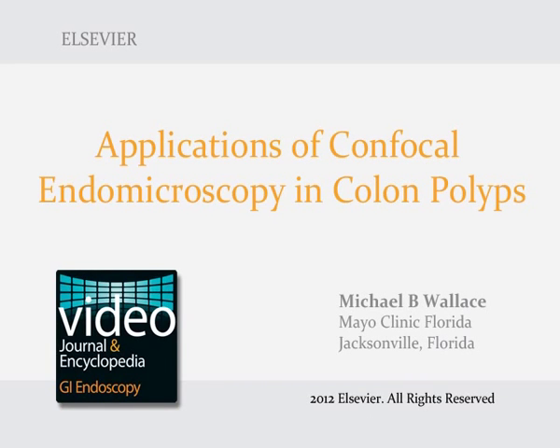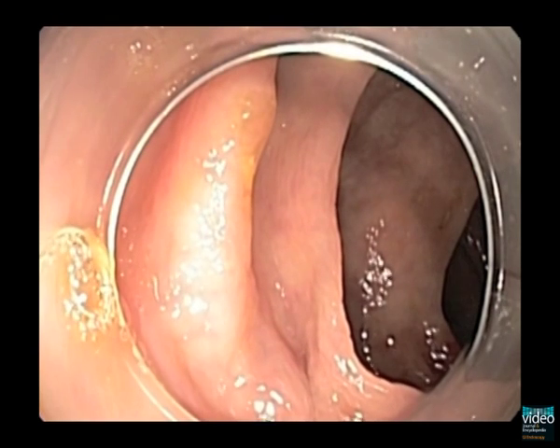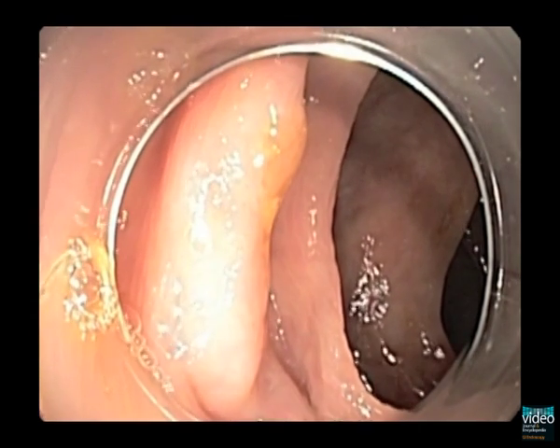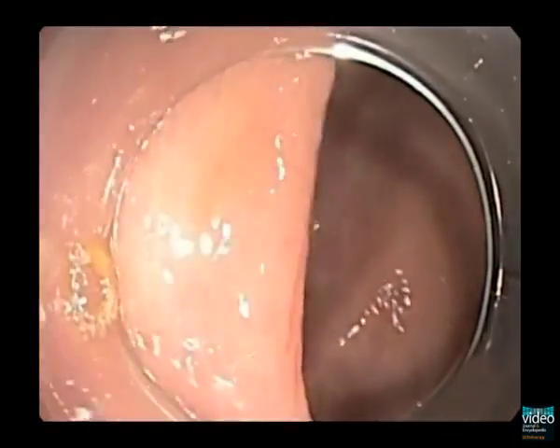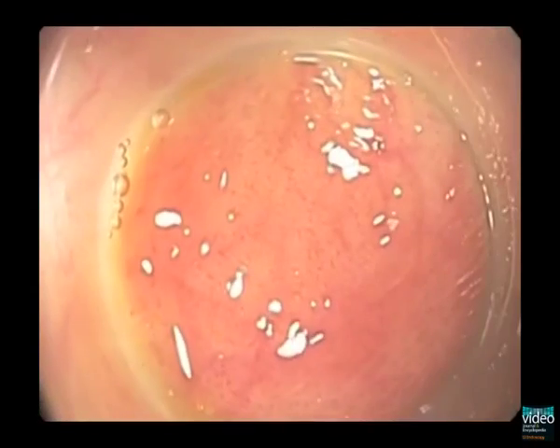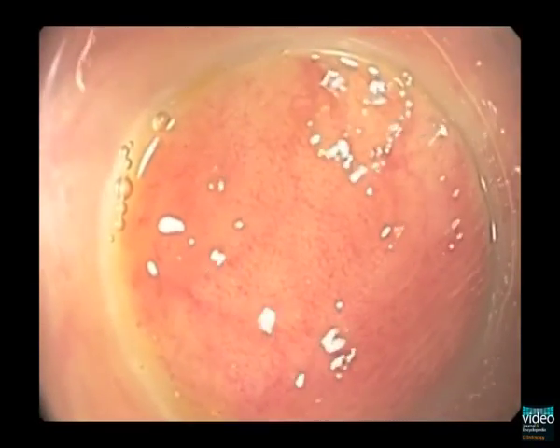In the following video, we will demonstrate several applications of confocal endomicroscopy for colorectal polyps. In the first video, we identified an area of very subtle abnormality, and it was unclear if this represented a true polyp or not. The lesion is now seen in the central part of the window.